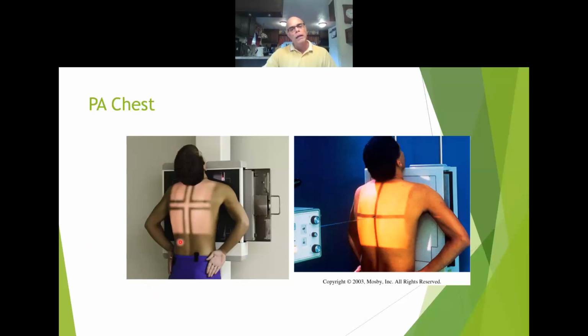So as I'm walking away, I say, go ahead and blow that air out. Now take in a second, much deeper breath and hold. And that's going to help over expand the lungs so that we are really getting a good picture of them. The exposure is made after the second full inspiration to ensure the maximum expansion of the lungs. The lungs expand transversely, anterior, posteriorly, and vertically, with vertical being the greatest dimension. So that's what we want. We want to expand those lungs in all dimensions that they can.